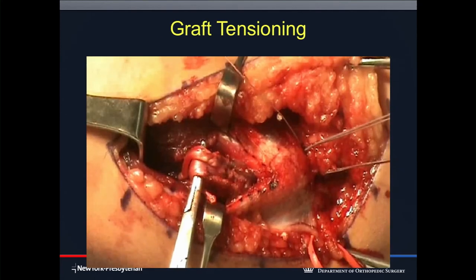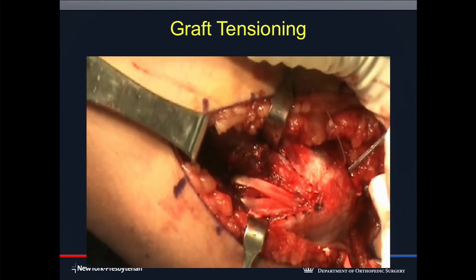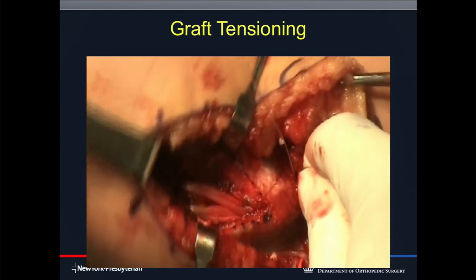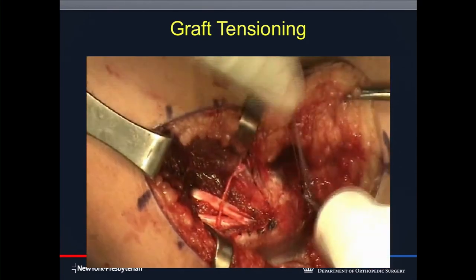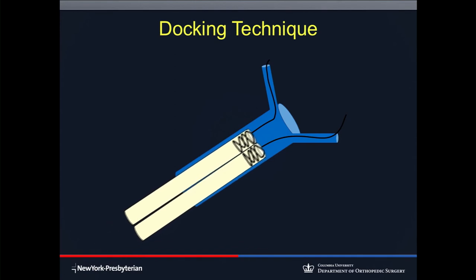This is what it looks like. The graft limbs have to be the right length, and the longer the bone tunnel, the more healing and the easier this is going to be. I can tell you this is satisfying when you do this. In fact, between you and I, sometimes I take it out and I do it again. And then you tie over the bone bridge. This is what I mean by the technical aspects. When everything's going beautifully, you've got this big long tunnel, 20 millimeters, 15, maybe 25, and you get these exit tunnels right at the end.